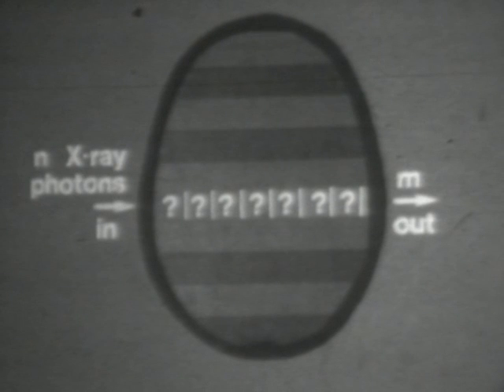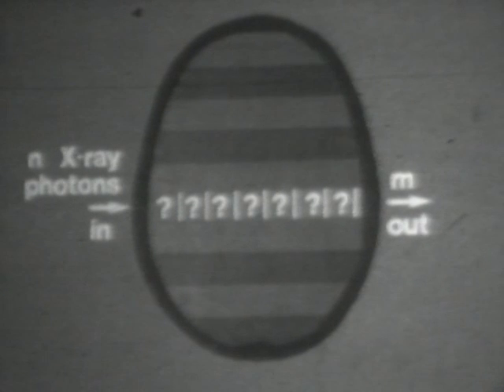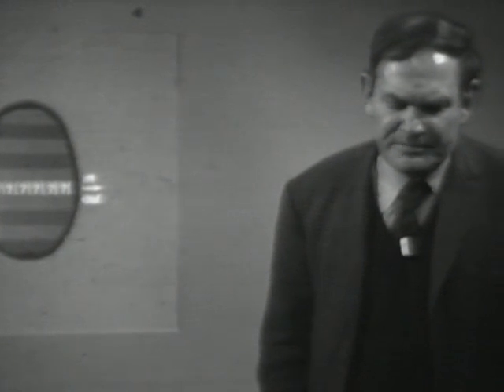X-ray tube. This is then followed by a 1-degree rotation of the whole gantry around the circumference of the slice, and the scanning motion is repeated, and so on until a rotation of 180 degrees has been completed. In 1968, Mr. G.N. Hounsfield, a research engineer at EMI, effected a solution to this problem.